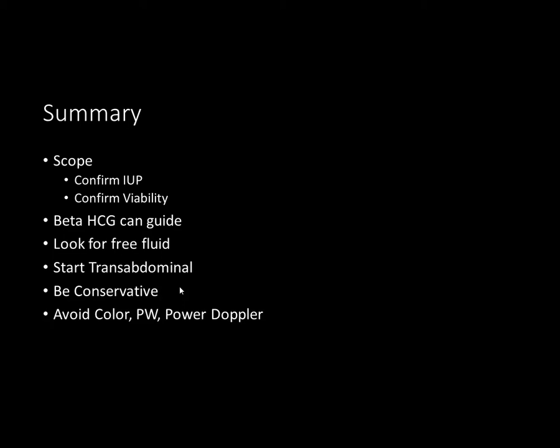Finally is safety. Keepsake ultrasound and repeat scans during pregnancy have not been shown to be harmful. However, it is strongly recommended that these are not performed and that ultrasound is only used if medically necessary. When possible, avoid color, pulse wave, and power Doppler, as these have higher energies and have theoretical threats to the health of the baby.